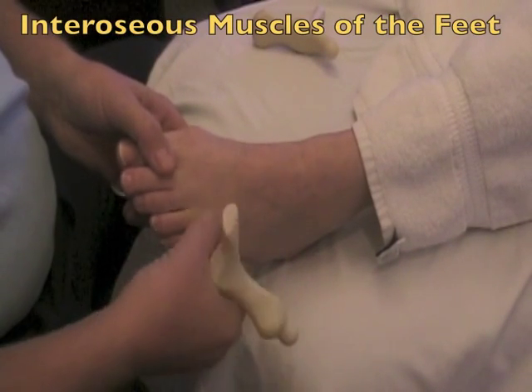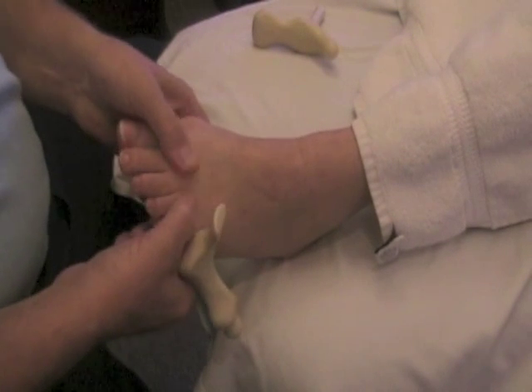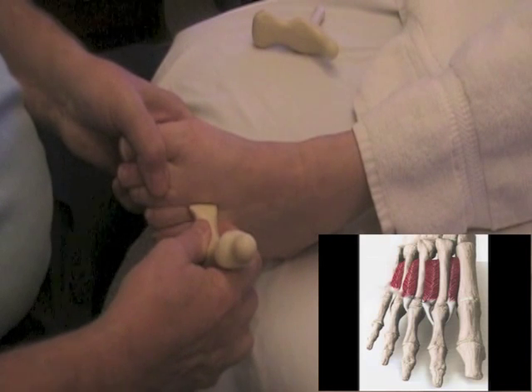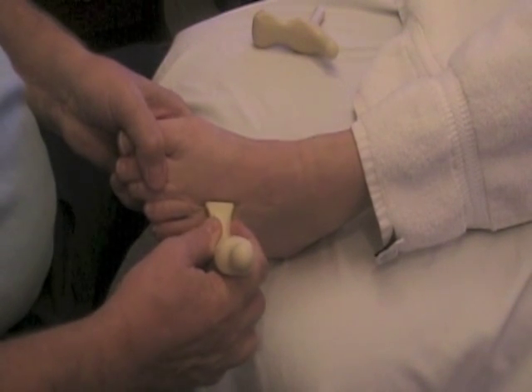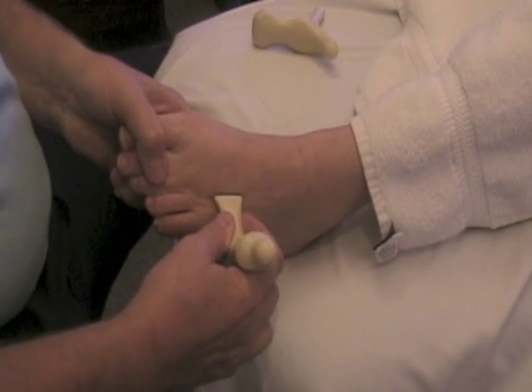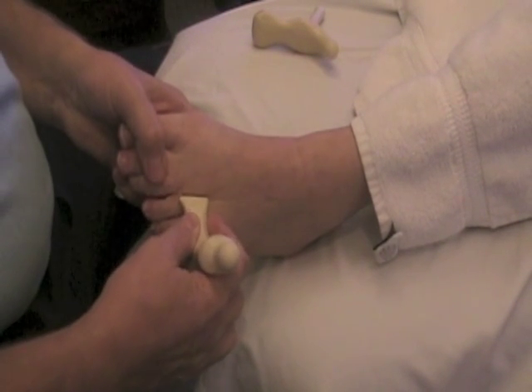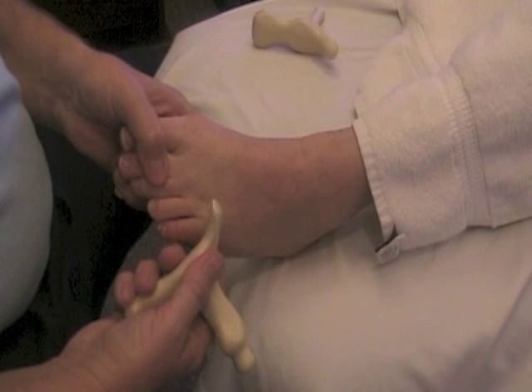You'll also find this tool works perfectly in the feet. You can run your thumb up in between the metatarsals and feel if there's a restriction between the bones — some bones you'll find have a lot of restriction, some move quite freely. This little tool will slide right in there and release those interosseous muscles, which you have an awfully hard time getting with your fingers. Obviously you need to start slower on some people and work a little deeper over maybe a few sessions. You can work absolute miracles on people who have problems in their feet. It feels very little like muscle pain, but it produces almost miracles when you get the areas cleared up.